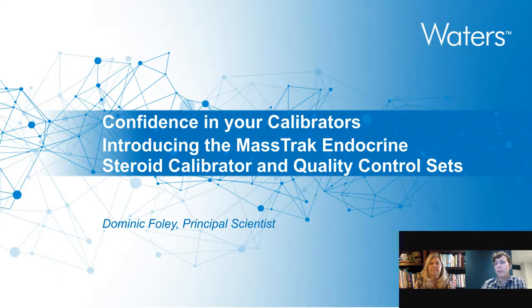We know that they do provide fairly clean samples and provide a concentration effect to improve analytical sensitivity. There are possible alternatives using, say, liquid-liquid extraction, and we have demonstrated a liquid-liquid extraction sample preparation technique for steroid hormones found in this calibrator and quality control set. So it is possible to do it that way.